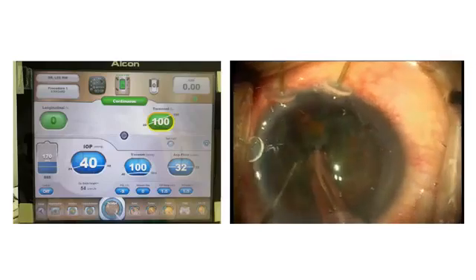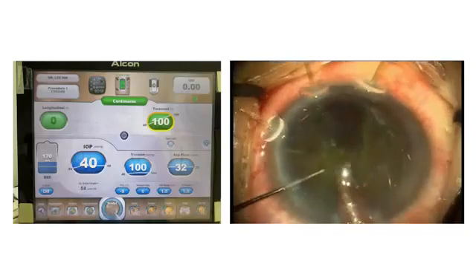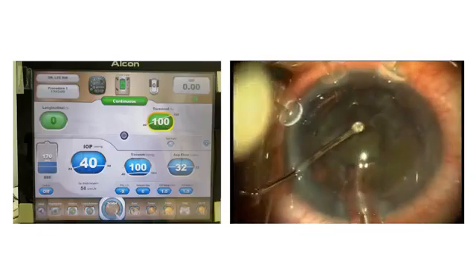So surgery, again, having in this case supported the capsule with the retractors, proceeds quite normally, as in any other case. And again, what you want is this. I mean, the video doesn't show too much different because the settings have been optimized.